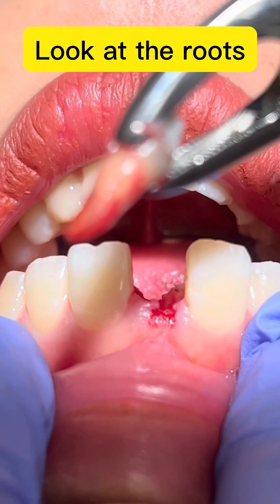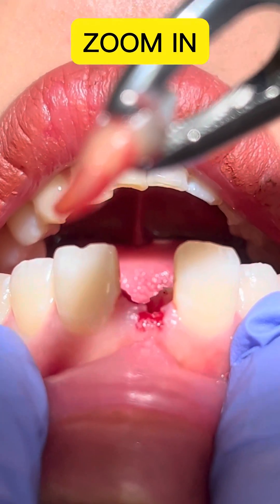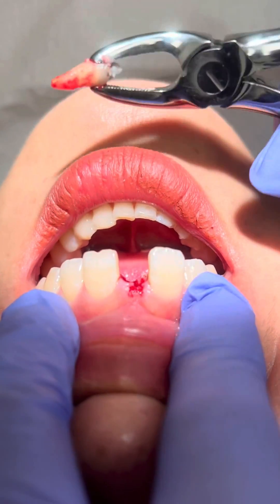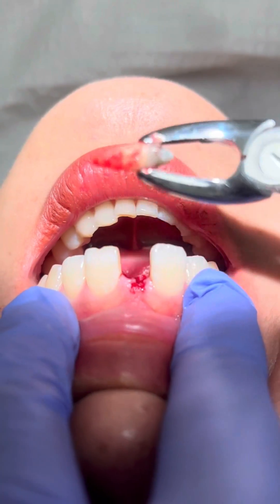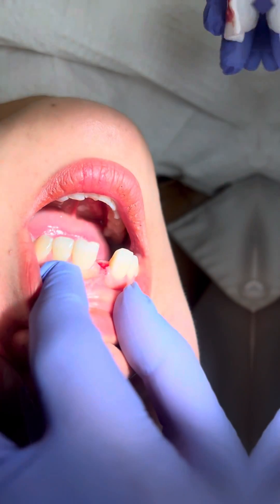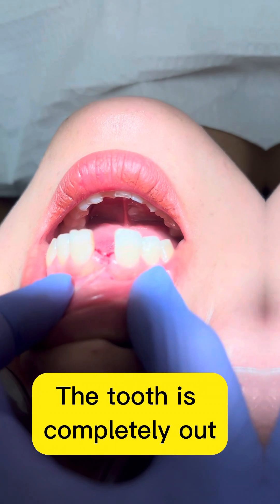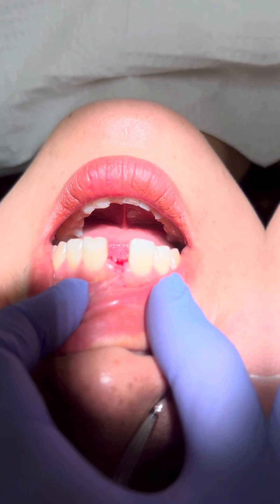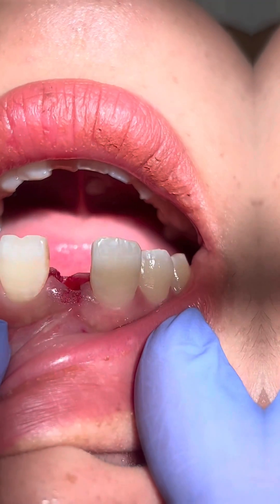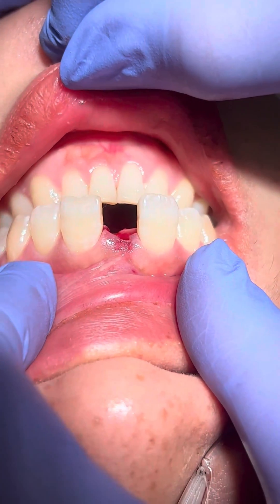Look at the roots closely. Patient was provided with a prescription and post-op instructions. Patient will come back for a post-op appointment.